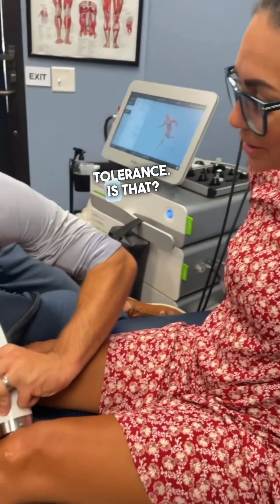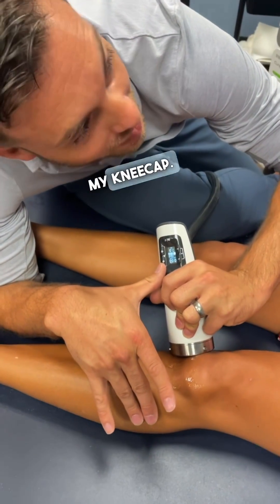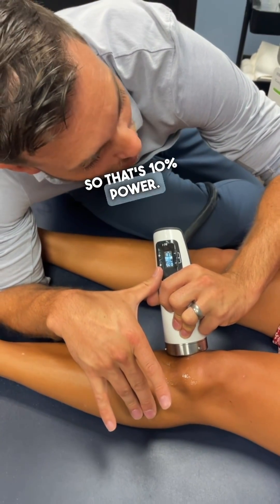Pain — high pain tolerance. That's like going through my kneecap. Isn't that crazy? So that's 10% power, and we can increase it from here.